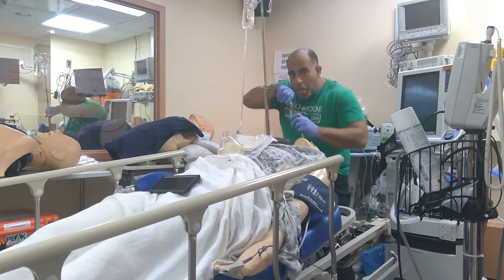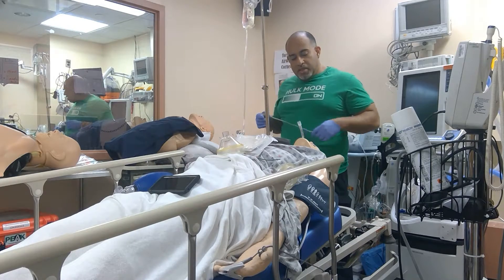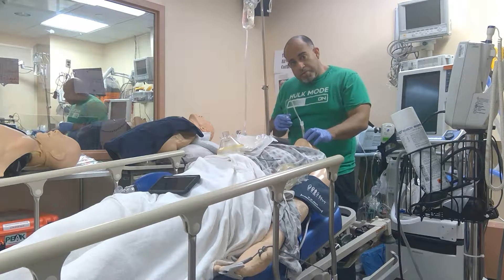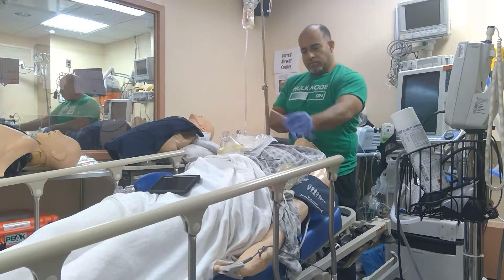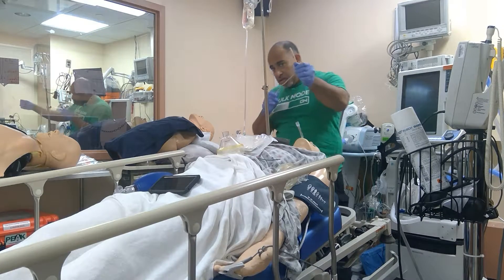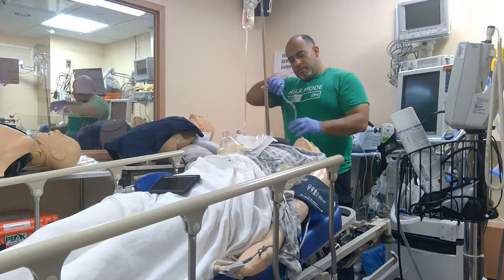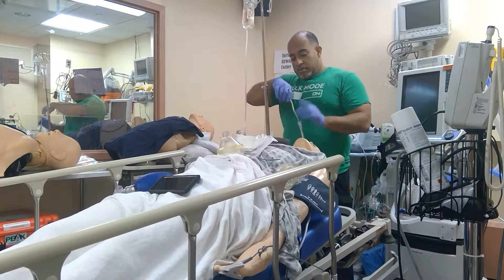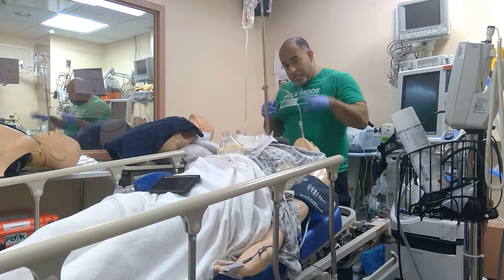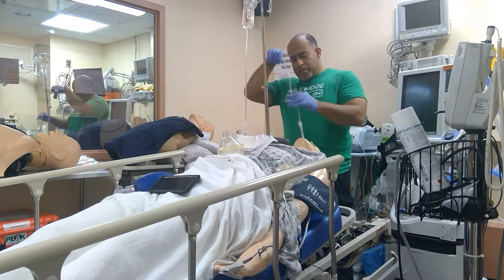You still need to do this eventually. If there was an obstruction, you may tell because when you're putting it in you see the patient's teeth clenching — that's an external obstruction. Look how long this thing is going down the mouth and the back of the airway. It should pass all the way to the right mainstem. If there's an obstruction, maybe it's very distal in the mainstem or locked up in the periphery, but at least you've ruled out a proximal main obstruction.